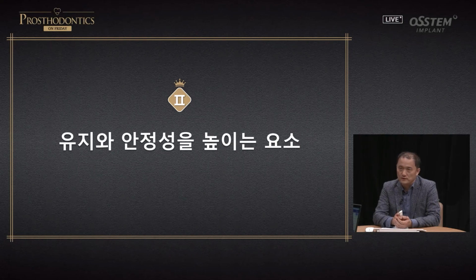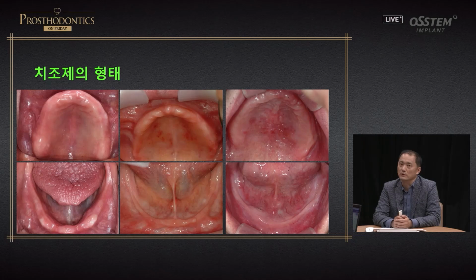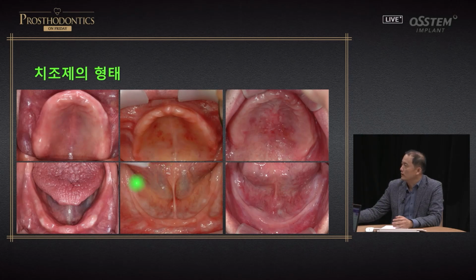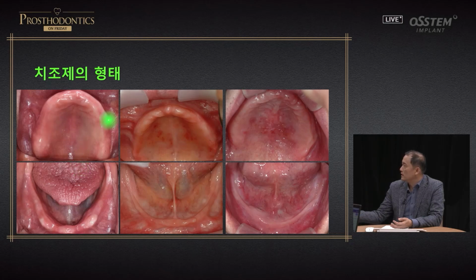Now, what are the then element that increases retention and stability? There are, in the textbook, many you can find, but clinically, what you first need to see is the form of the alveolar ridge. If, as you see on the left, if it's really good like this, then with the sufficient retention, stability, you could have good results on your hand. But as you can see on the second and third photos, if the alveolar ridge is not in good conditions, it's really difficult to have good retention and stability. So it's really hard to keep the full denture in its place.